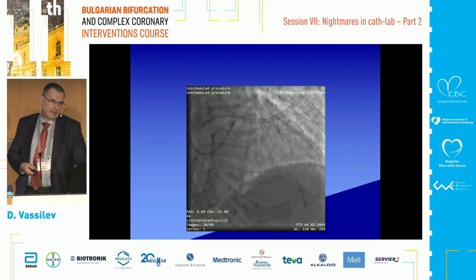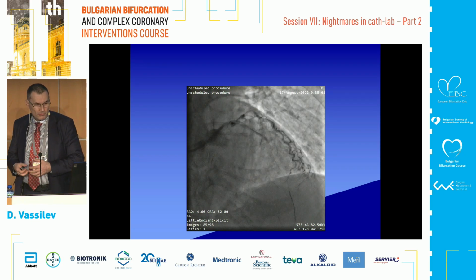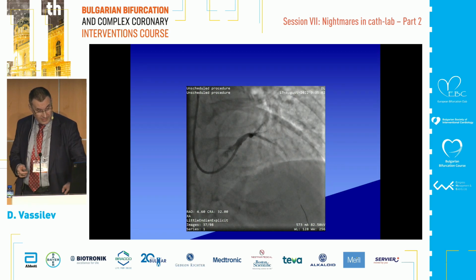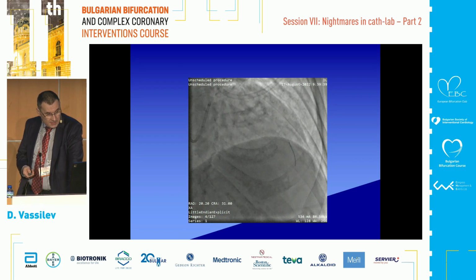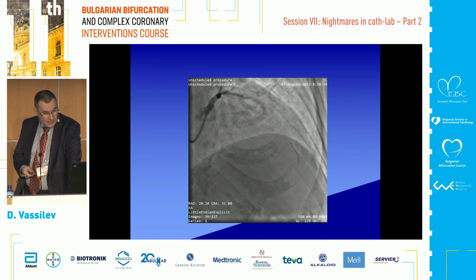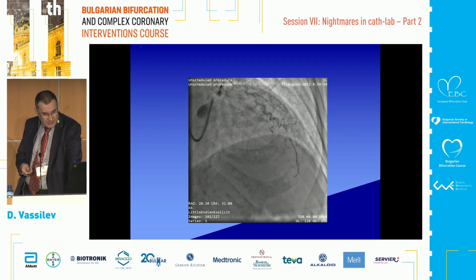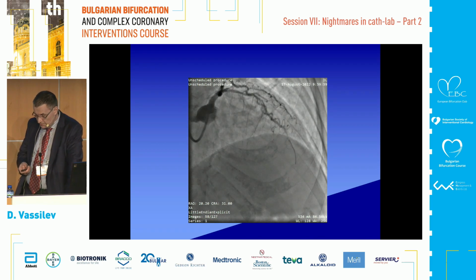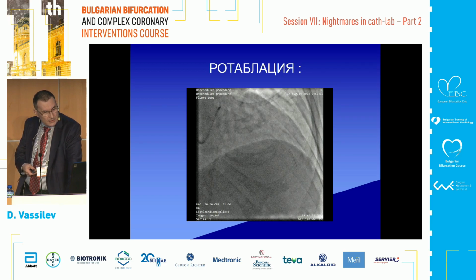This is after the next approach and the next balloon, and the vessel closed. We gave some nitroglycerin, again balloon inflation, and as you can appreciate, there is slow flow in the LAD with a dissection at the point where the balloon stopped. However, nothing could be done there.